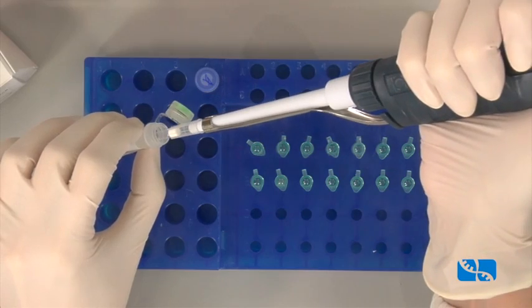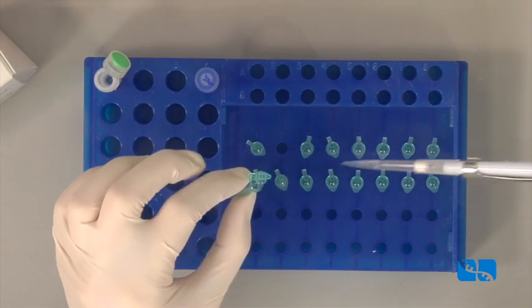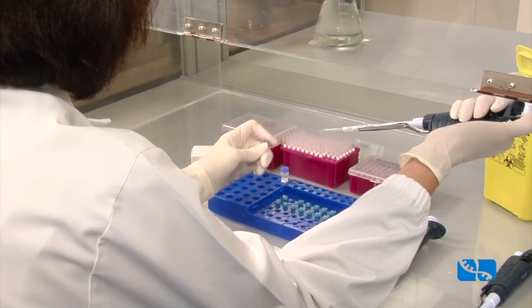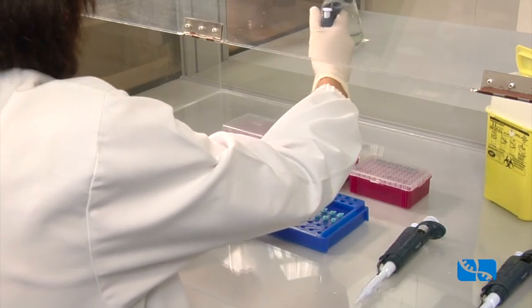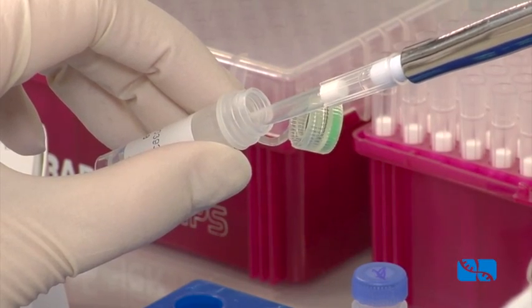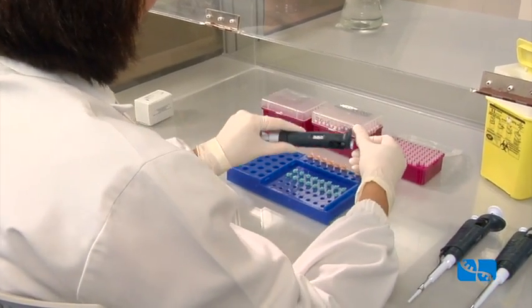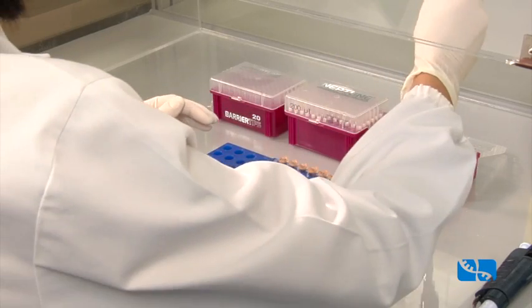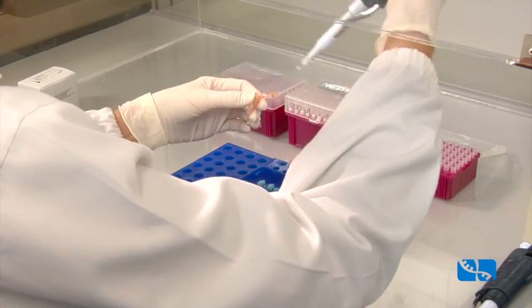Once these tubes are ready, they can be stored at 4 degrees Celsius during 5 days or at -20 degrees Celsius for a month. If PCR is going to be performed, keep the tubes at room temperature and proceed by adding samples. All kinds of samples, swabs, liquid-based cytology and paraffin sections are prepared in the same way. From each sample, pipette 6 microliters into its corresponding PCR tube according to the number of samples that are going to be analysed.